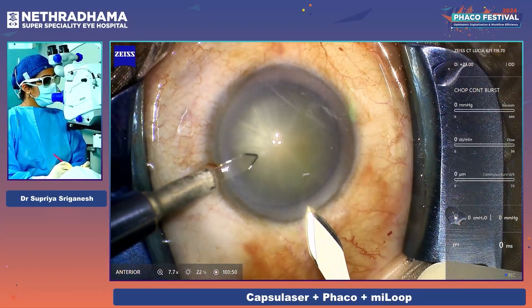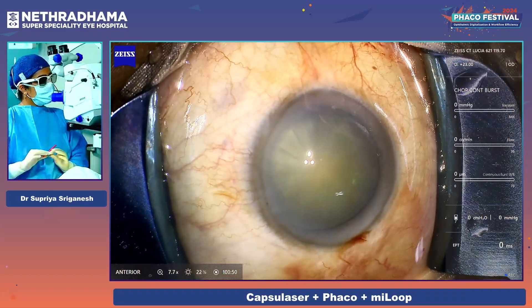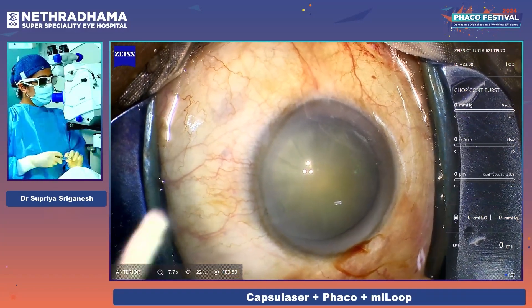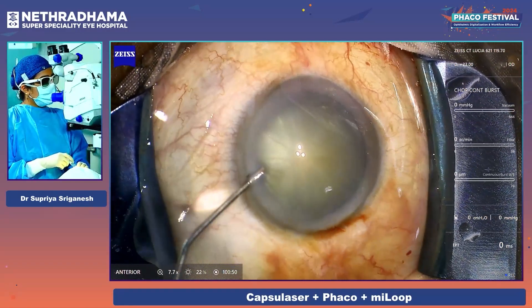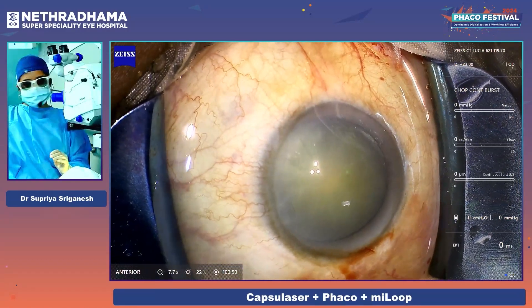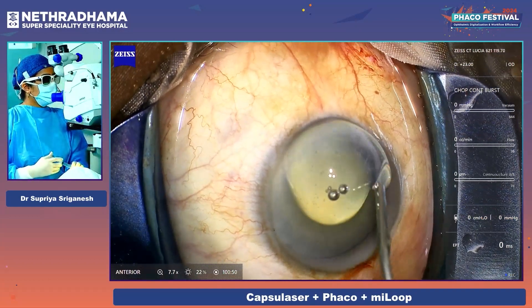That's the side port. This side port helps me keep the eye in the right position, and I'm making the main incision. I'm just using a little bit of intracameral xylocaine and adrenaline — this is to prevent the iris from becoming floppy. And I'm just using plain HPMC on the cornea.